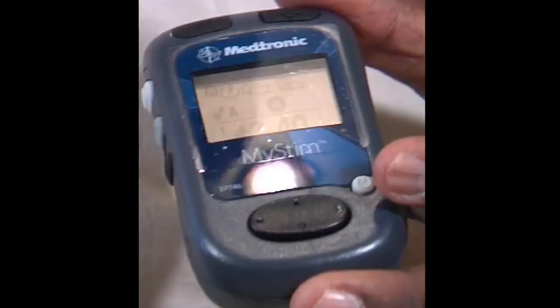The third component they all have is a handheld remote, which can be used to turn the device on and off and usually adjust the intensity felt through the spinal cord stimulator. Most of them are self-charging and last anywhere from 8 to 10 years. Some do not charge on their own and those need to be replaced every 2 to 5 years.